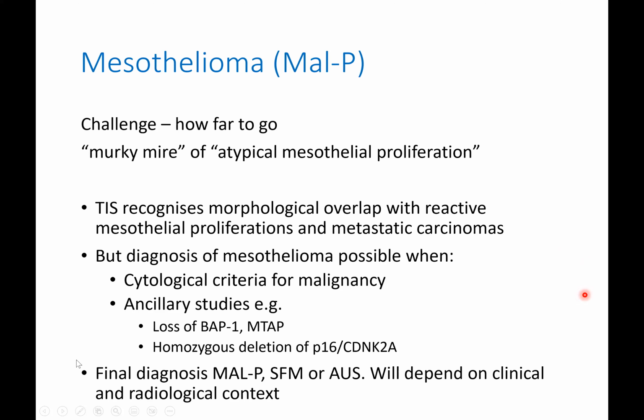In reality, a final diagnosis of either malignant mesothelioma, suspicious for malignancy, or atypical cells of undetermined significance will depend on correlation with the clinical and the radiological context.